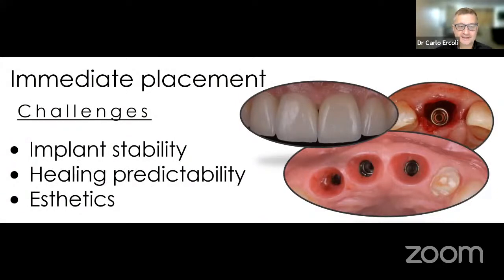My apology. So if we look at immediate placement, what are the challenges that we have? Of course, implant stability is one. The predictability is certainly important as well. But most important is really the aesthetics, the soft tissue that we're going to achieve.